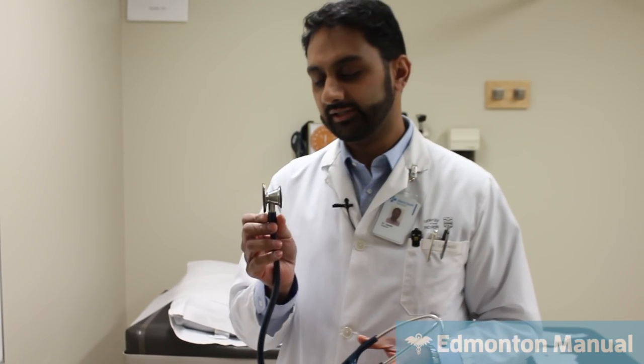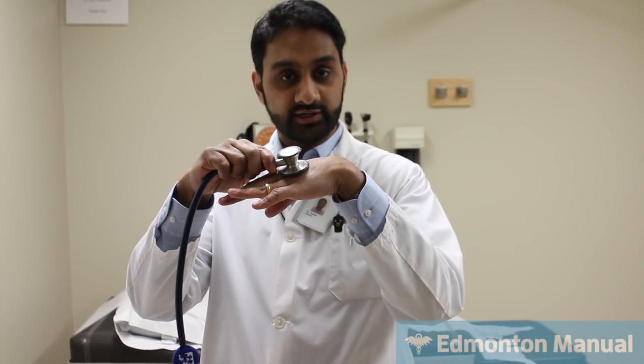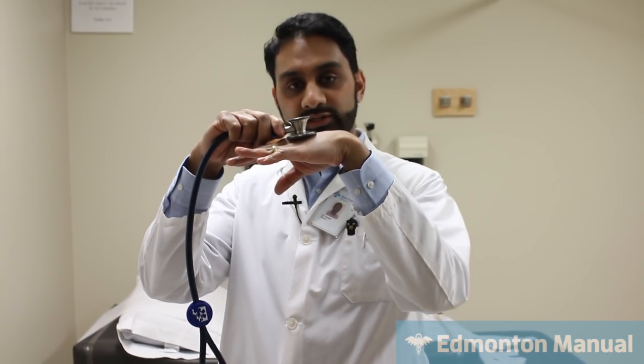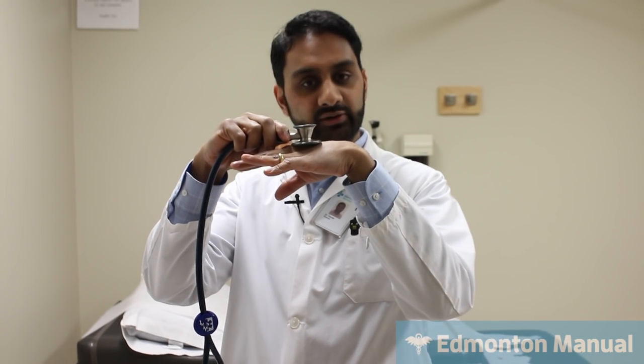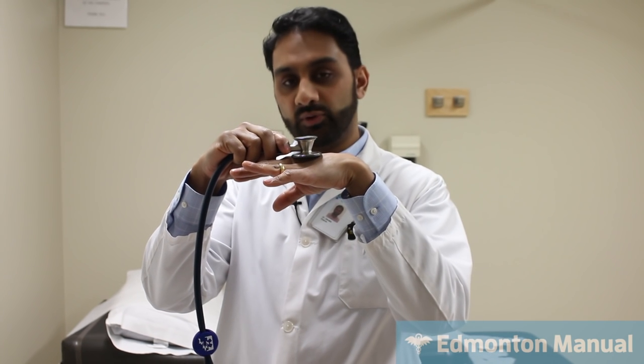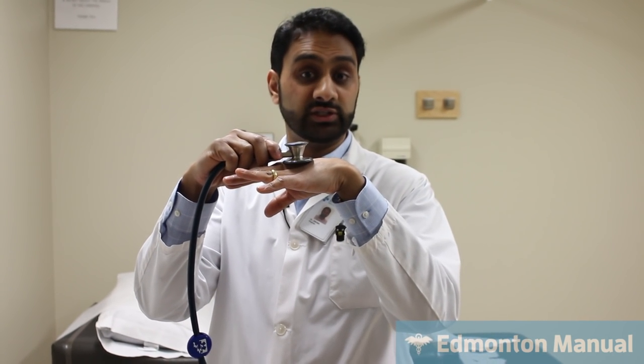So this is a Littmann stethoscope that has not been converted to the available bell kit. This is how it's usually sold, with both sides as a diaphragm, the larger side for adult and the smaller side for pediatrics. The way the tunable technology works is that when you push on the surface hard, it acts like a diaphragm, and thus it's mainly the high frequency sounds you tend to hear. Whereas if you let go lightly and just barely make a seal on the surface, it acts in bell mode. That removes some of the high frequency and emphasizes the low frequencies, and thus functions like a bell.